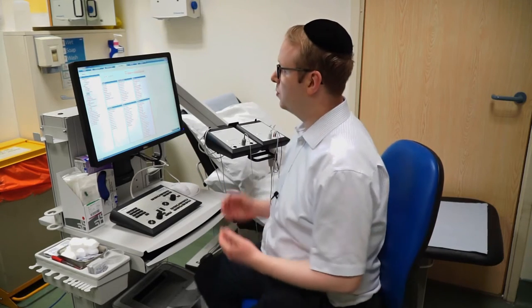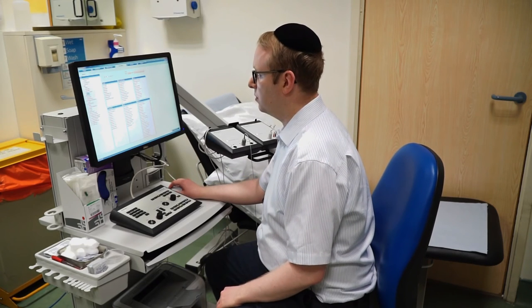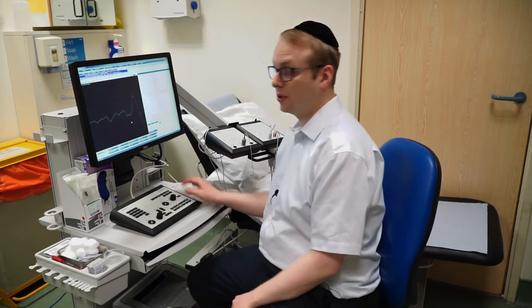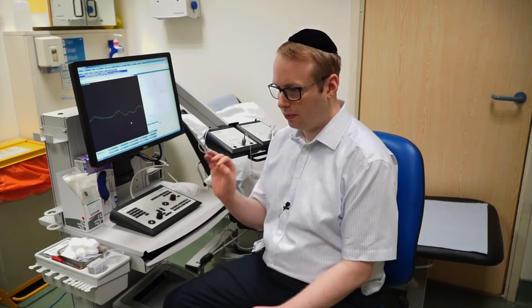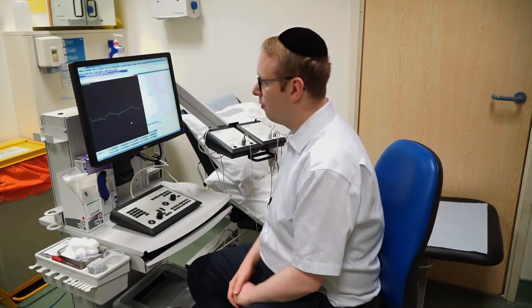The very first thing we're going to do is go to our test menu and select the muscle of interest. In this case, we'll set up with the tibialis anterior muscle. The first thing you should do is go to the Spontaneous Activity screen, where we can see what the muscle insertion is like and make sure that you're adequately in the muscle itself and close to the motor unit. I'll show you an example of this right now.